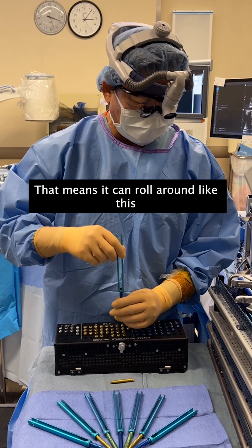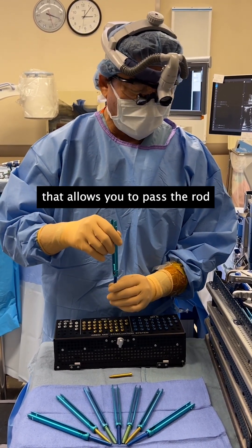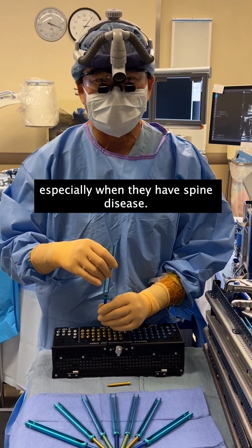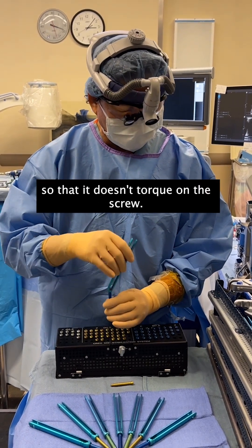It's polyaxial — that means it can roll around like this. That allows you to pass the rod and you don't have to put the screws in perfectly, because humans are not perfectly designed symmetrically, especially when they have spine disease. So you need that flexibility so that it doesn't torque on the screw.